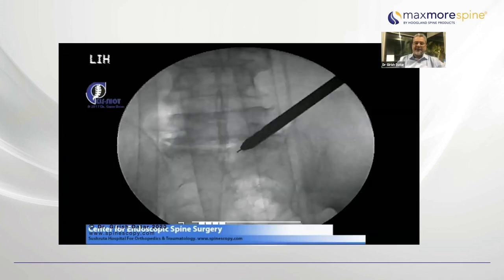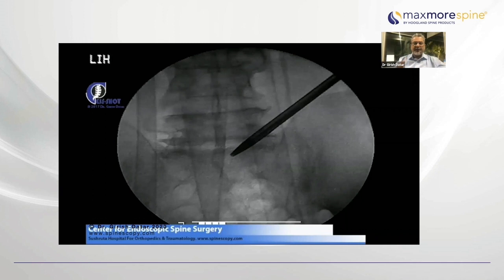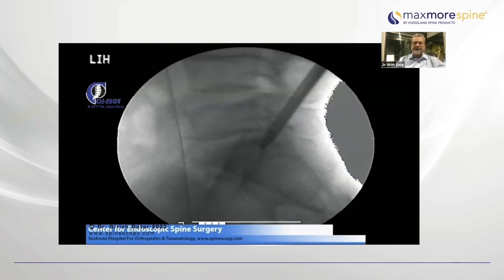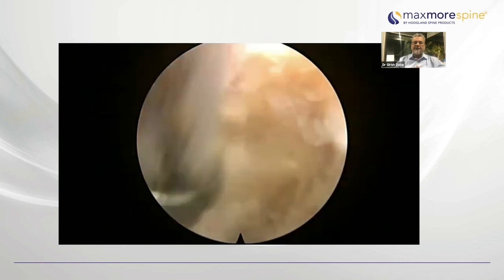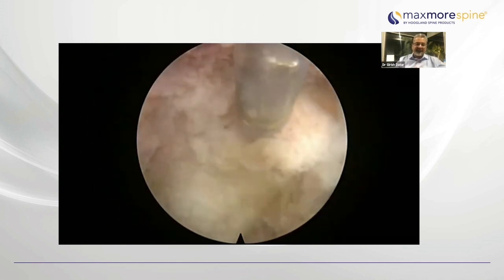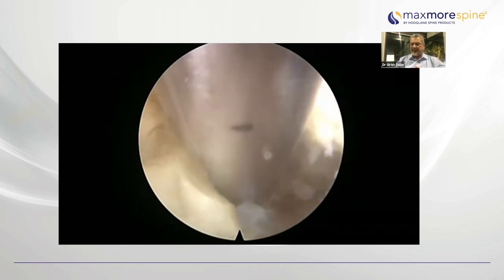So I'm taking my drills gradually, step by step, till the time I reach the medial pedicular border. You can go with your regular Tomshidi drills, Maxmore drills. But the moment you are more medial to that, then you have to shift to atraumatic drills, which will make it safer for the patient. Second most important thing is the patient is again awake and aware, so he is going to report inadvertent pain.